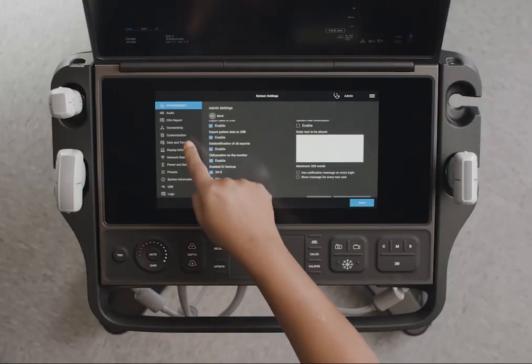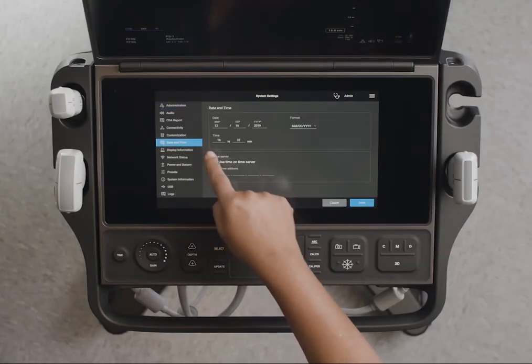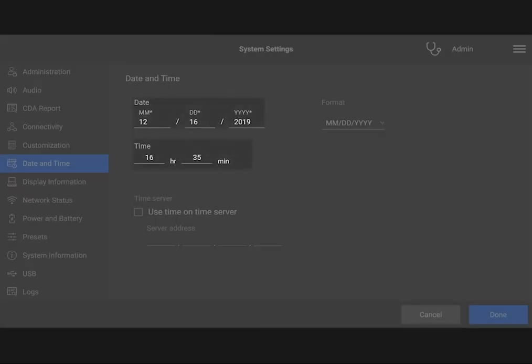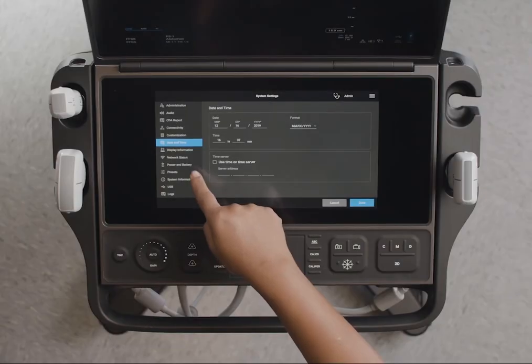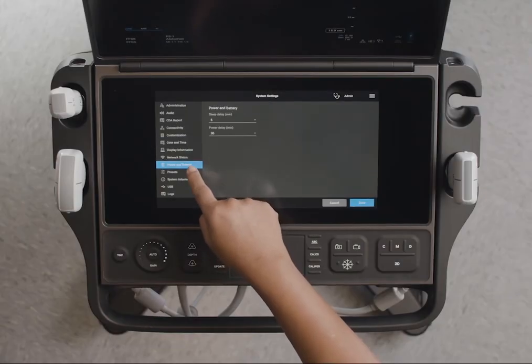Other system settings can be configured by any user. For example, adjusting the date and time. Now let's adjust the sleep mode to off.